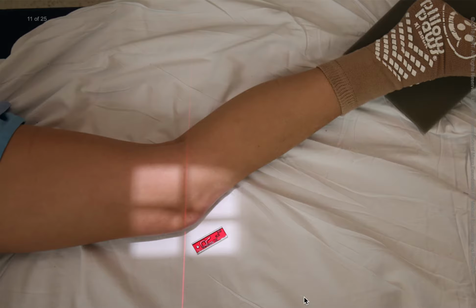The patient's gonads are shielded, and the shield is placed between the X-ray source and the patient. The patient is instructed to hold very still, but no breathing instructions are necessary.